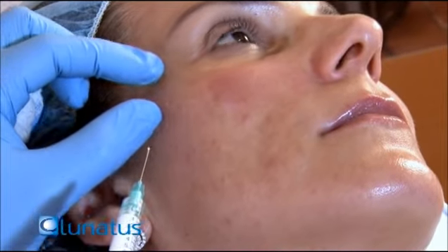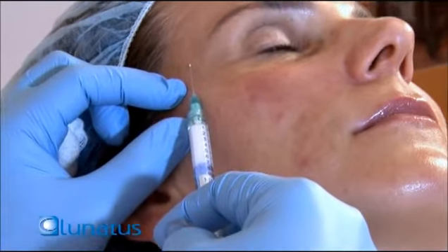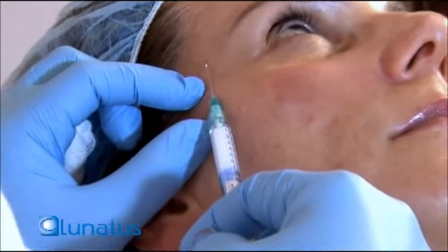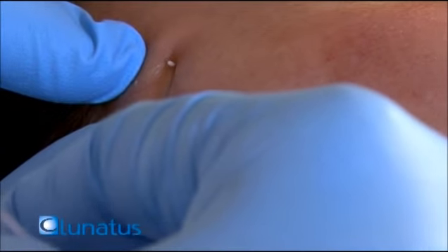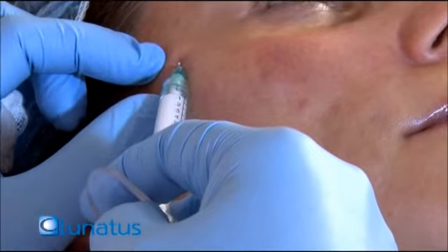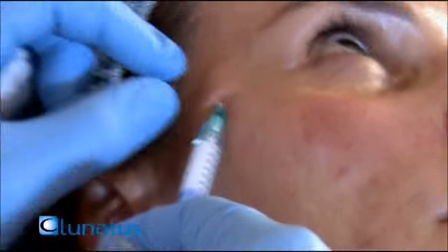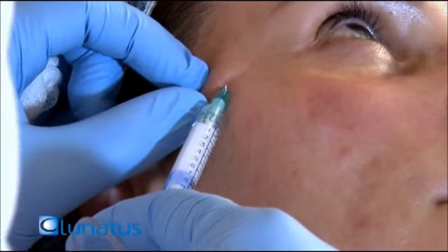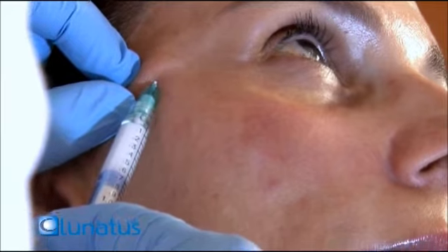The way I like to approach it is that I've got the bone right over here, that's where the arch is. I'm going to be putting my needle right where the arch is and I'm going to go from this area and deeper. I want to try to avoid all the major structures. I'm basically right where the muscle is, quite deep. You can definitely go perpendicularly if you want to — a lot of people do that — but I like doing this approach.